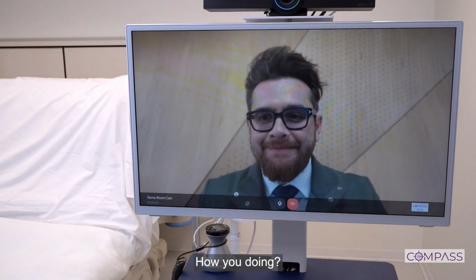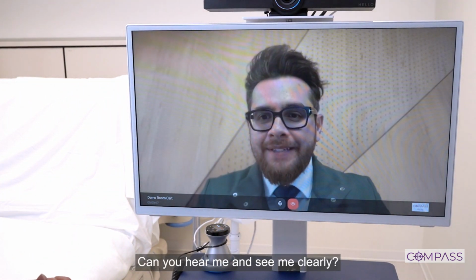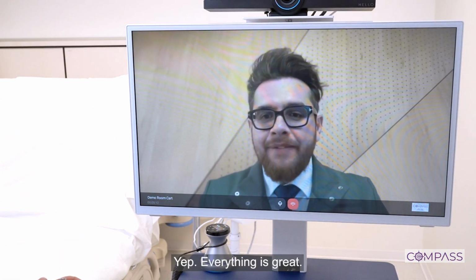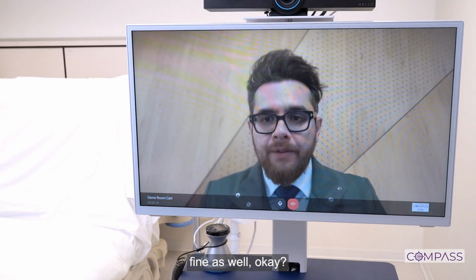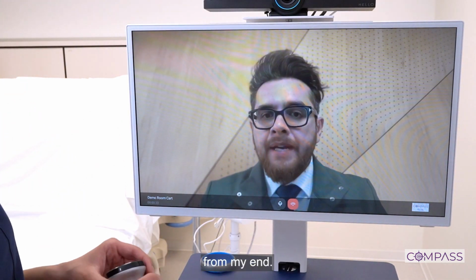How you doing? Good. How are you? Good. Can you hear me and see me clearly? Yes. How about you? Can you see me clearly? Yep. Great. Everything looks great. Good. How about this? Let's make sure the digital stethoscope is working fine as well. Okay. Perfect. So I will be starting the virtual examination from my end.